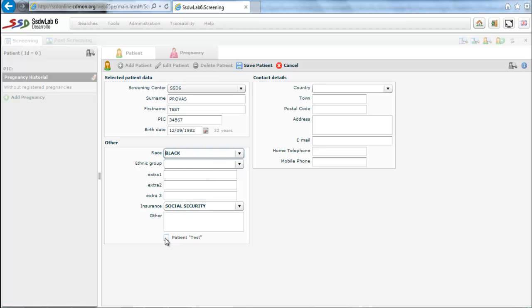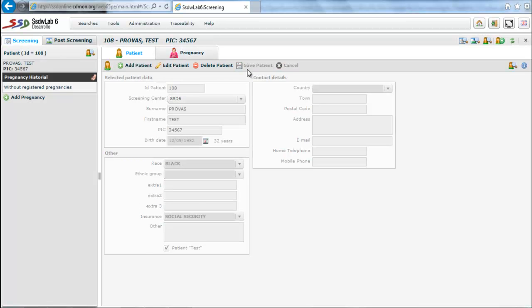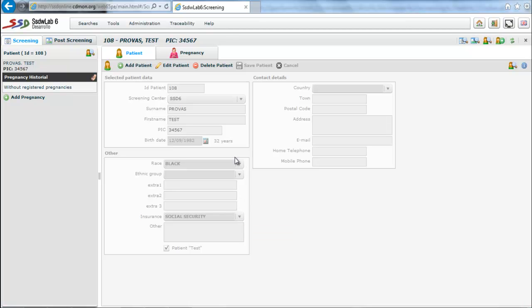The option patient test makes that all information relating to this particular patient in screening is considered by all program options as a test or quality control, so that none of your data will intervene in statistical calculations.